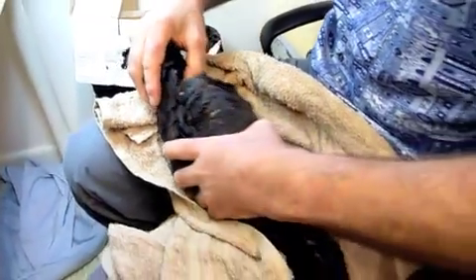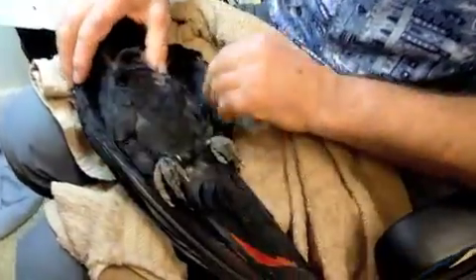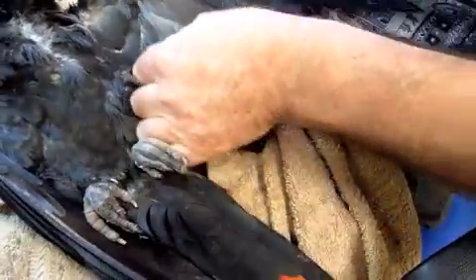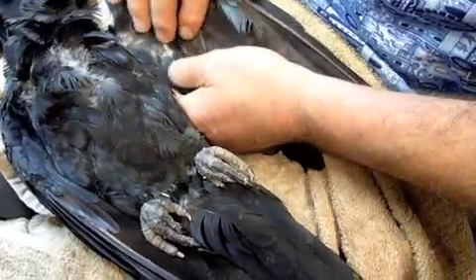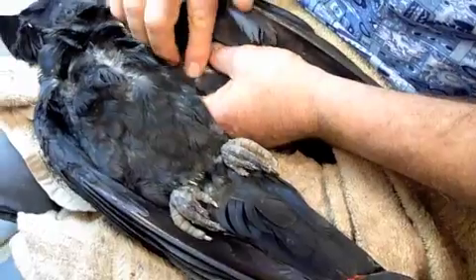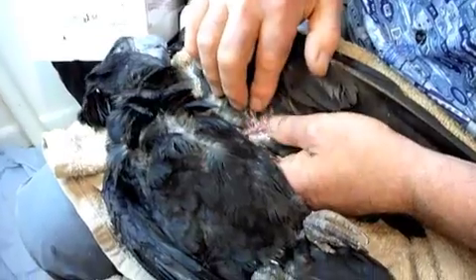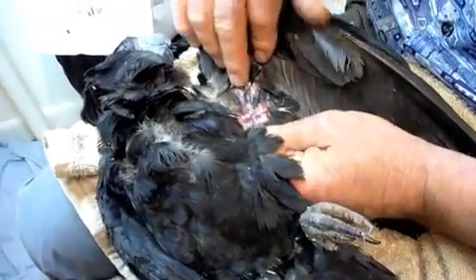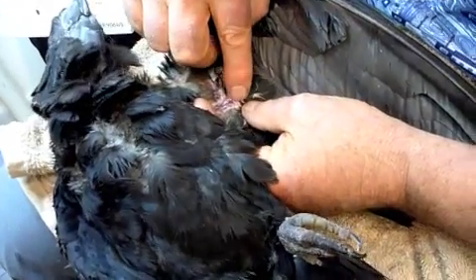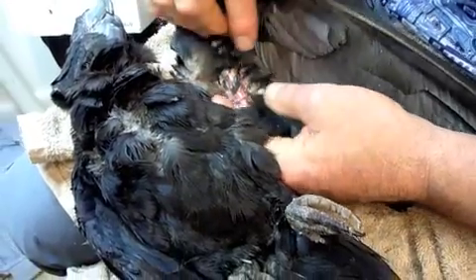Alright, we'll have a look under a wing — have a look at the elbow. We'll part the skin there and put pressure on up here with this finger. We've got a vein coming up there, it's only a little one, but we'll have a shot at that in a moment.